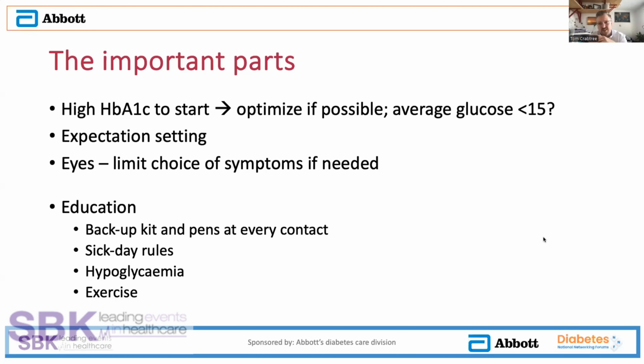One of the other things that I think is really important is expectation setting. I've had a few people who've gone onto a pump thinking that it's literally going to keep their blood sugars at 7 for the entire time, and that's not a realistic expectation. And lots of the pumps, because of the way they learn, so perhaps I've seen this more with Omnipod than others, you may find that the first few weeks aren't the best whilst the pump learns about you, and then eventually things will get better.